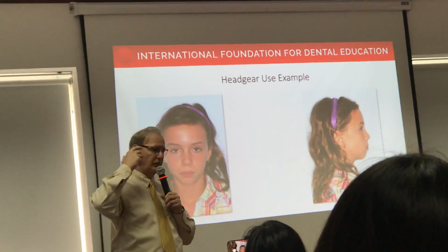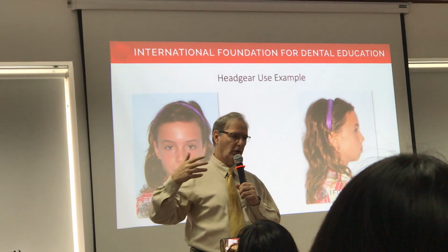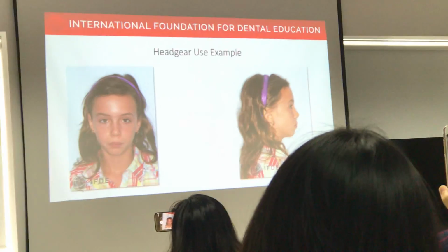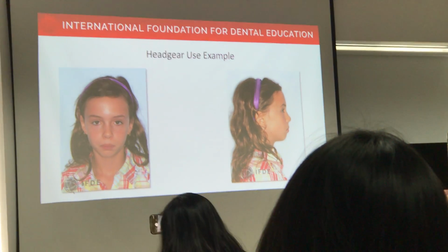If you have burned anchorage, especially on the upper arch when the molars come forward pretty fast, you're stuck. Như vậy thì nếu như chúng ta cẩn thận ngay từ đầu thì chúng ta sẽ đến được cái đích rất là nhanh. Còn ngược lại, nếu như mà ngay từ đầu chúng ta đã mất neo chặt rồi thì về sau chúng ta sẽ bị tắc.